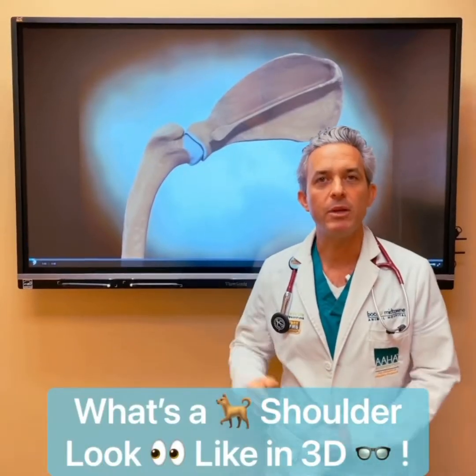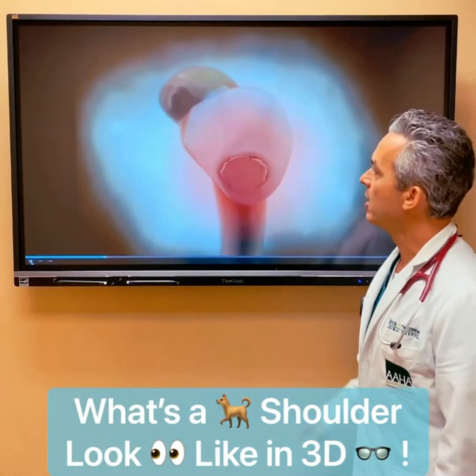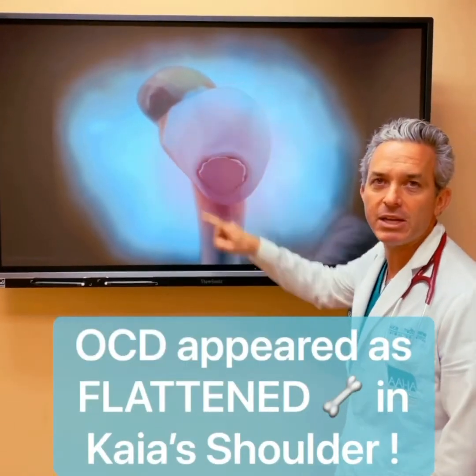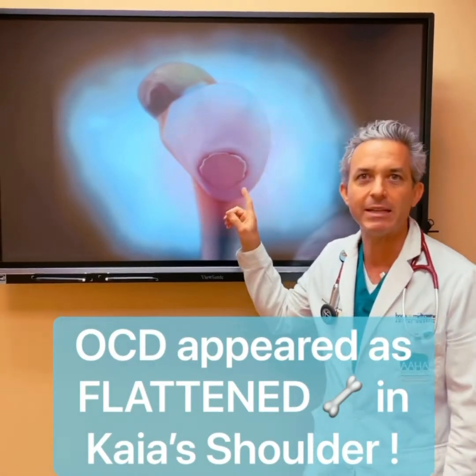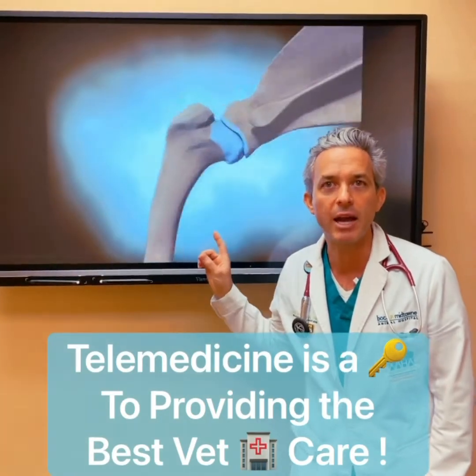Behind me you can see a shoulder joint in a dog, and we're going to see what it looks like with this condition. Here you can see an area that starts to appear flat. This is a condition called osteochondrosis dissecans — a defect in the cartilage in this joint that the radiologist was able to clearly see on Kaya's films.